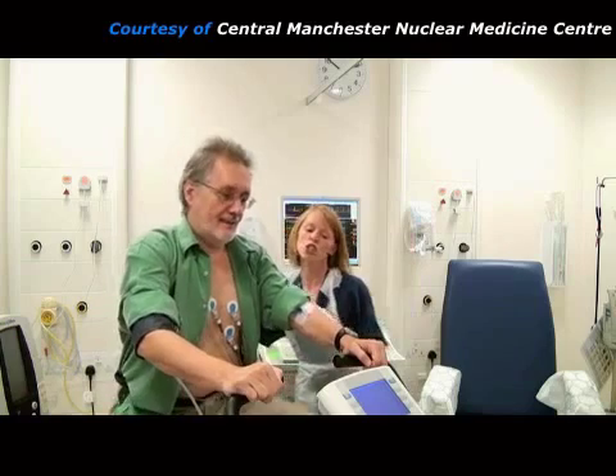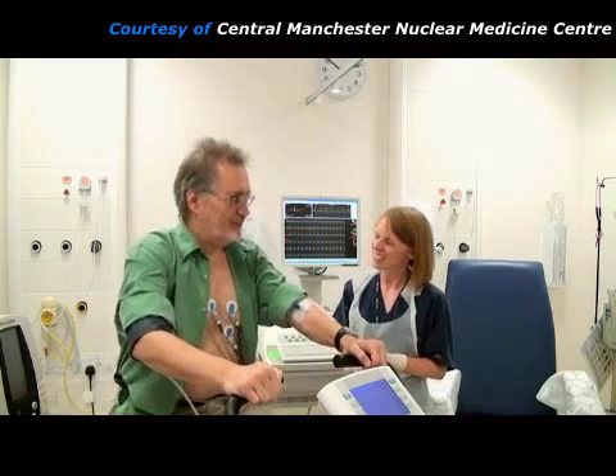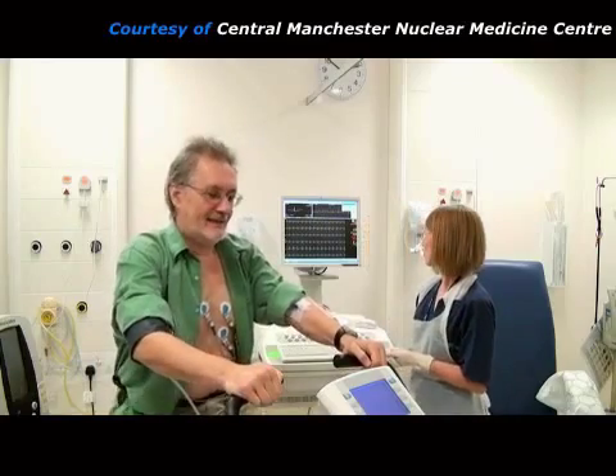As soon as it is injected, the radiopharmaceutical goes to the heart muscle to reflect the myocardial blood flow at this moment of maximum stress. The patient must continue to exercise for a further 2 minutes and then they can relax.